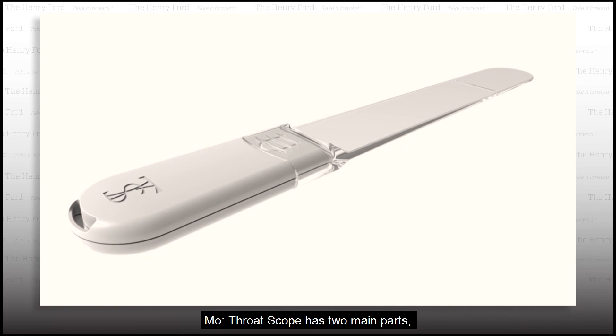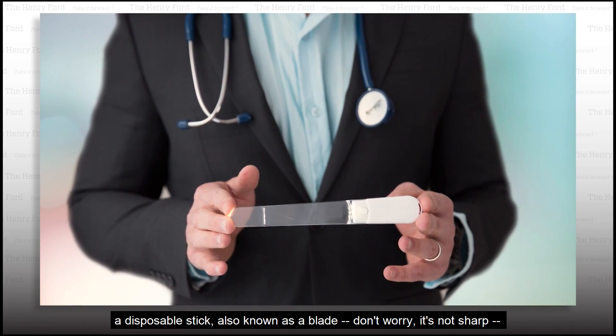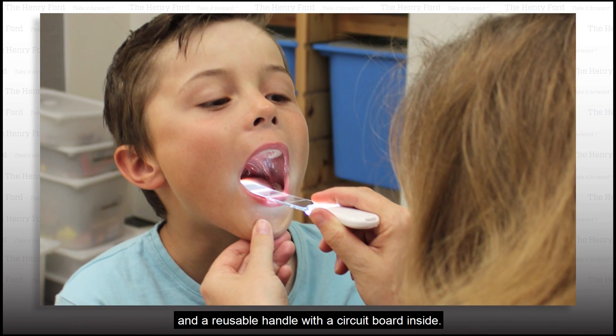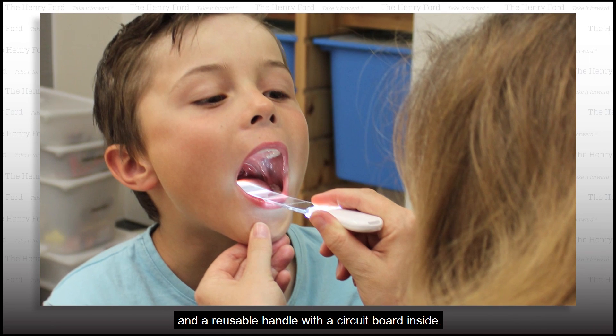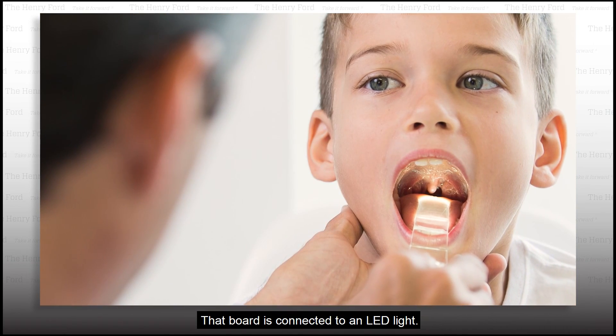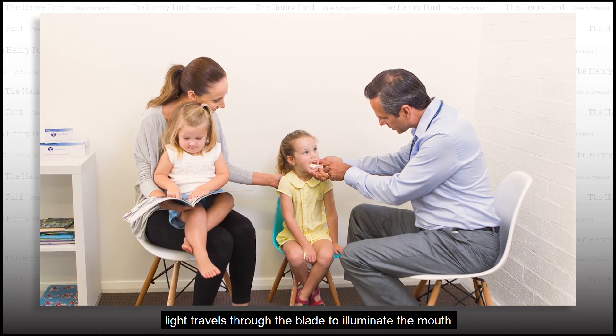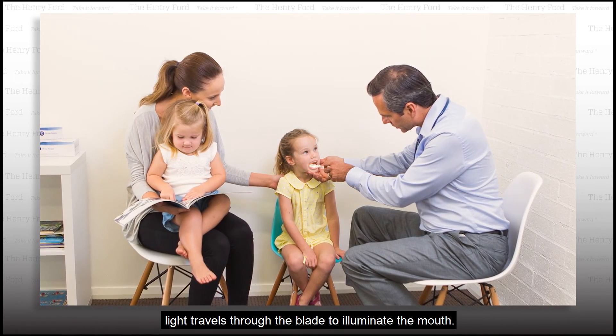Throat Scope has two main parts: a disposable stick, also known as a blade — don't worry, it's not sharp — and a reusable handle with a circuit board inside. That board is connected to an LED light. Once you connect the blade to the handle, light travels through the blade to illuminate the mouth.